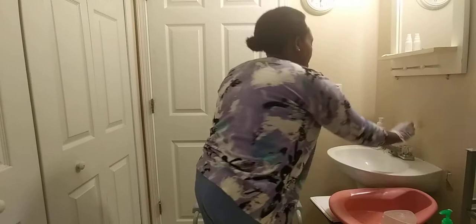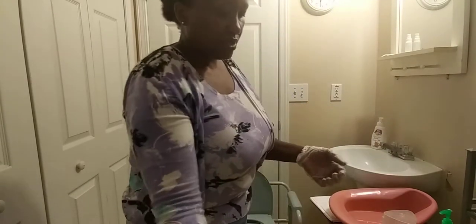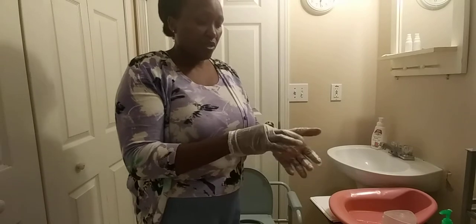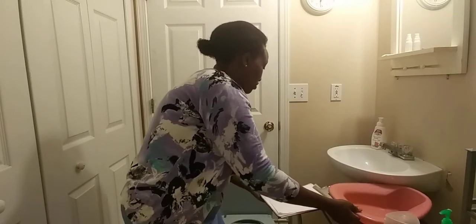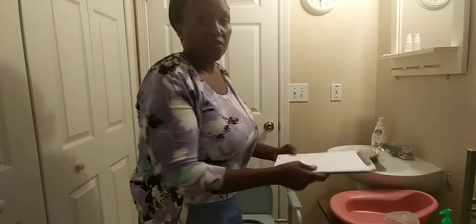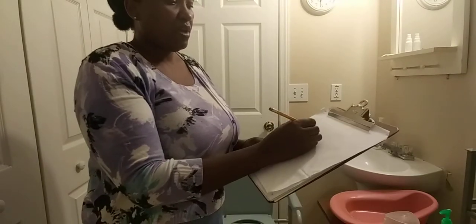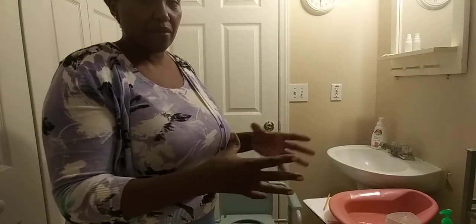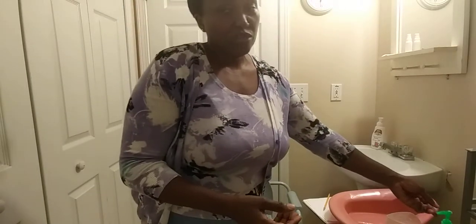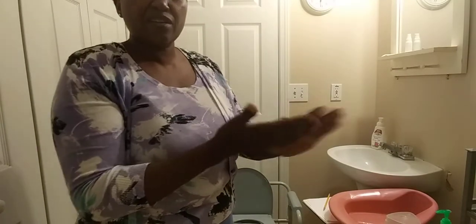Turn off the water. Put the paper towel in the trash. You want to remove the gloves without contaminating yourself, then put them in the trash. Wash your hands. Do not forget to document — I had 650 ml. Do not document in ounces; it's supposed to be ml or cc. Wash your hands, then the skill is complete.